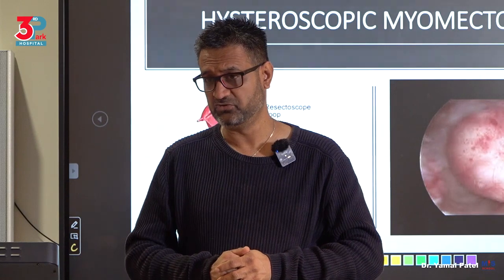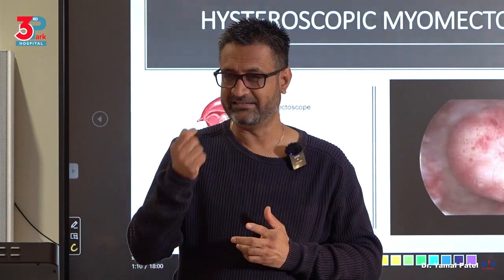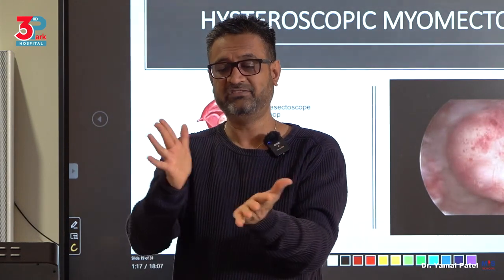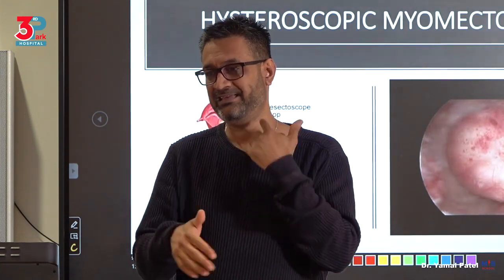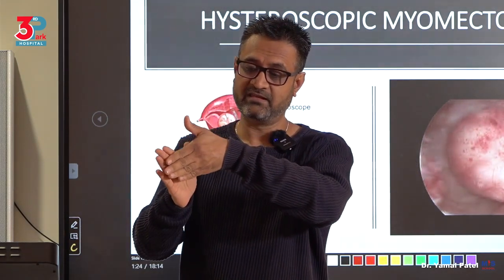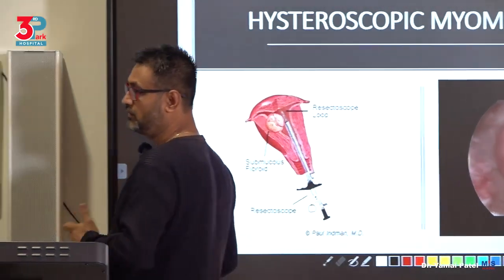There is very little endometrial tissue in Asherman syndrome as it is. It's thin and it's damaged because where it was stuck, there is no endometrium between that. That's why it got stuck. So this is myometrium stuck to myometrium. You separate it and you use energy, then again, you damage the base with that burn. So you don't even allow the endometrium to probably overgrow it. So trying cold scissors dissection in synechiae is better than energy. Got it?